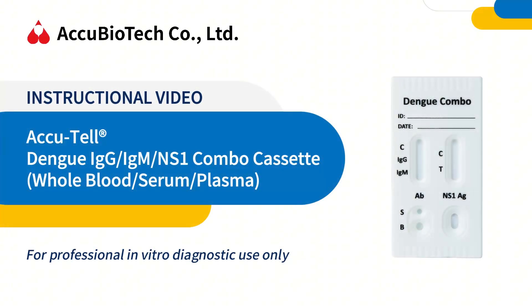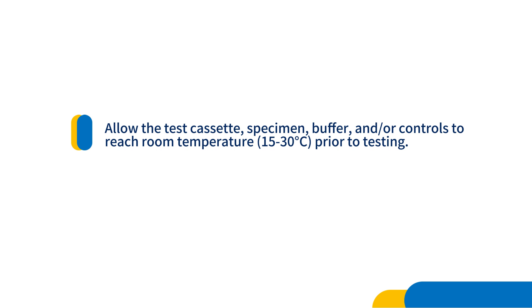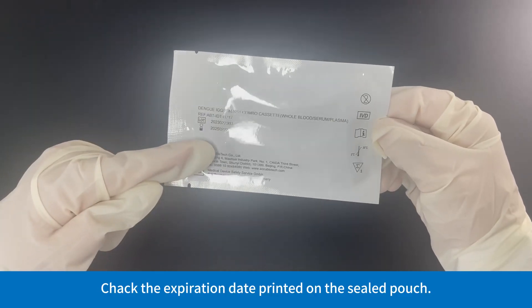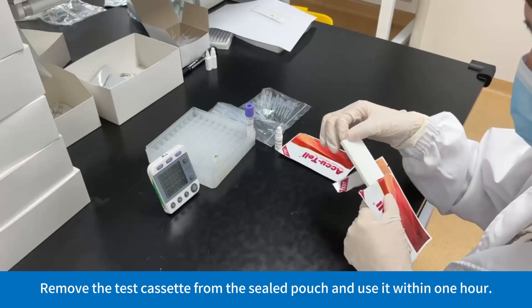Dengue IgG, IgM, NS-1 Combo Cassette — Whole Blood, Serum, Plasma Instructional Video. Allow the test cassette, specimen buffer, and/or controls to reach room temperature (15 to 30 degrees Celsius) prior to testing. Please read the instructions carefully before use. Check the expiration date printed on the sealed pouch. Remove the test cassette from the sealed pouch and use it within 1 hour.